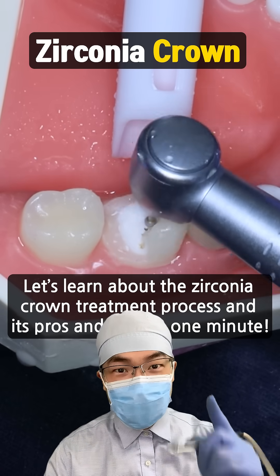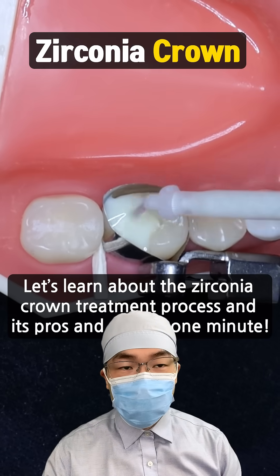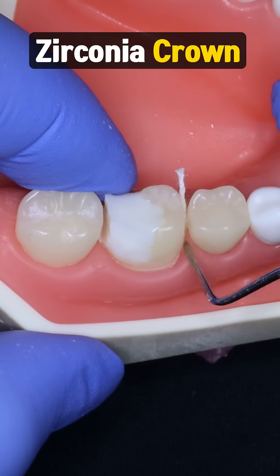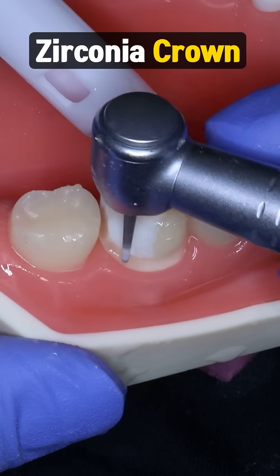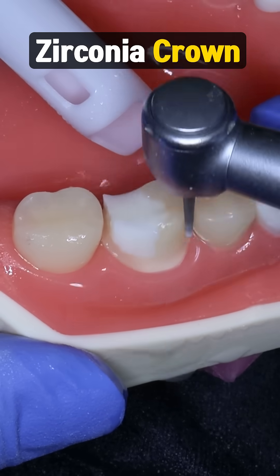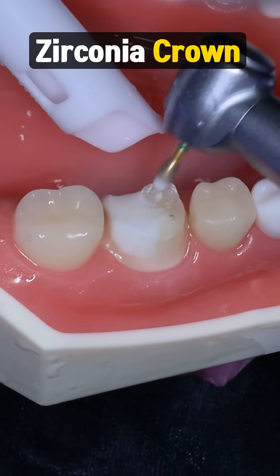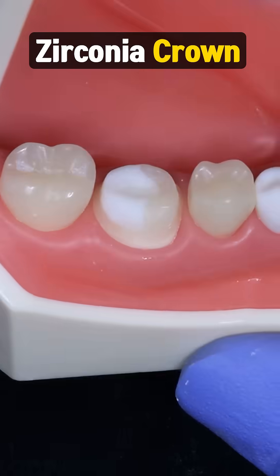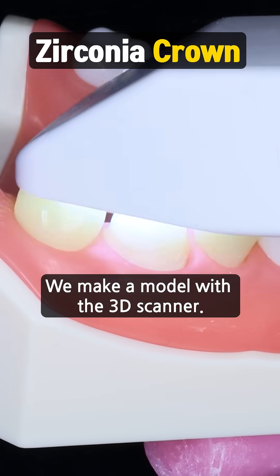Let's learn about the zirconia crown treatment process and its pros and cons in one minute. First, we fix and polish the decayed and broken tooth. Then we make a model with the 3D scanner.